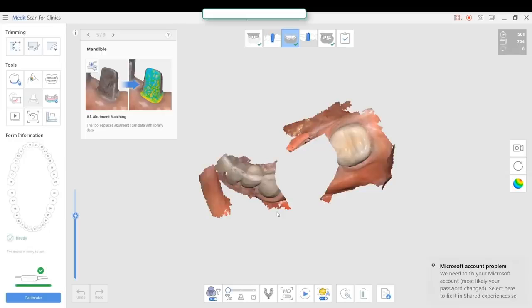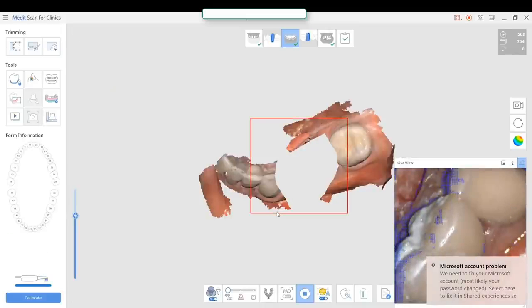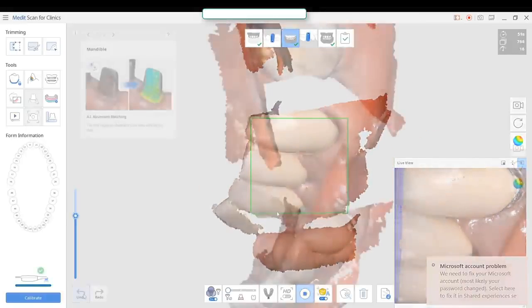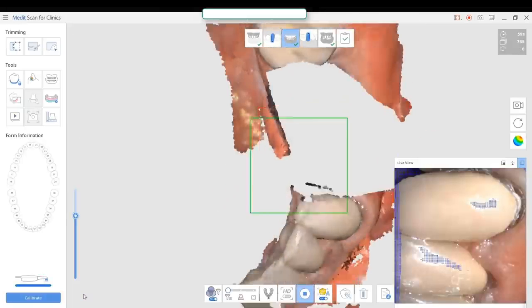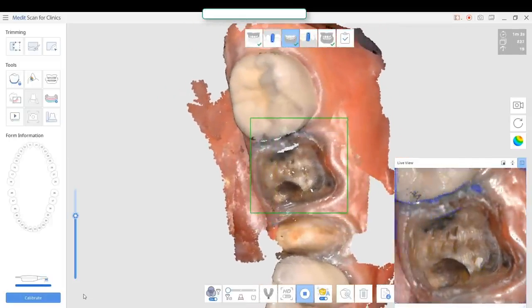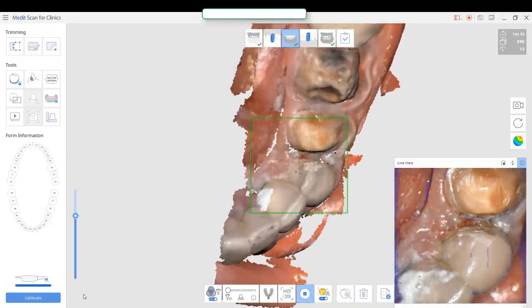imaging of the two refined preparations. So we'll turn the camera on and we'll engage the area mesial to the preparation, and of course getting good retraction and getting good hemostasis is really important. And now we start imaging the first premolar and the first molar. We've got hemostasis in most of the area.